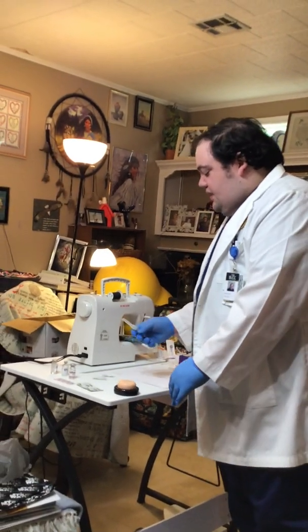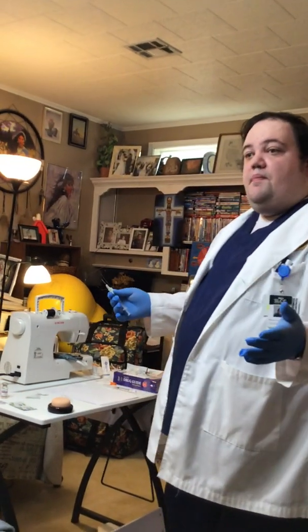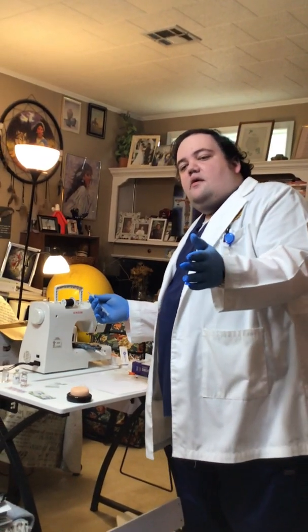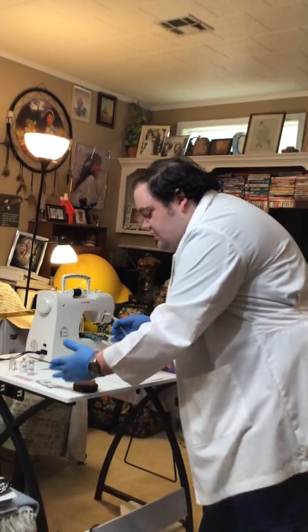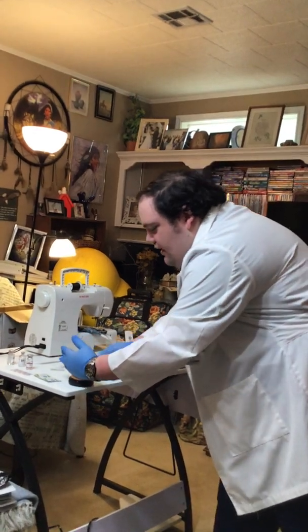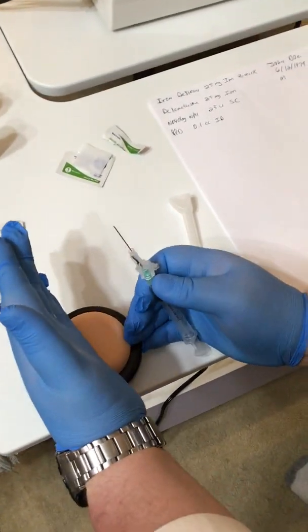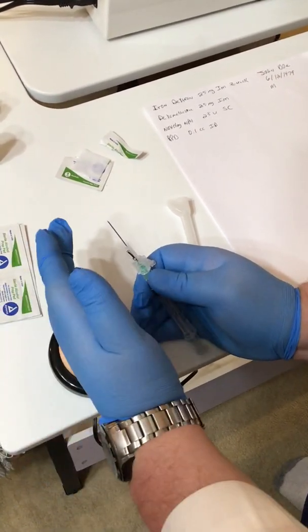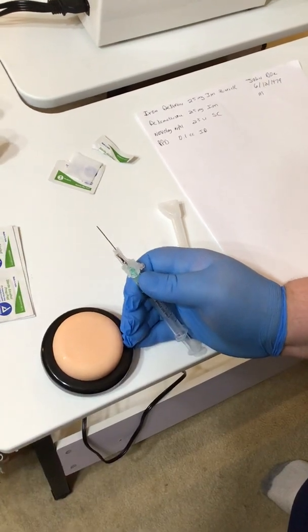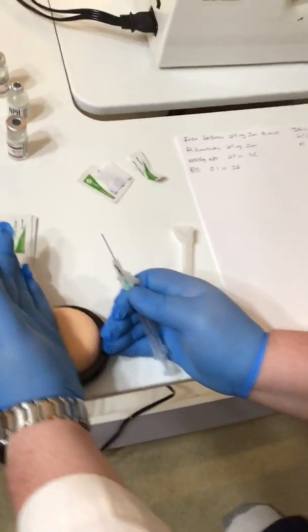So I'm going to take the cap off the needle, and of course, if the patient is in bed, we're going to turn him on his side. I've already explained all this process to the patient. I'm going to take my non-dominant hand. I know there are some shadows here. It's kind of slick, so we have to dry him off because it's not going to work. Kind of a wet glove there. I'm going to move him over like this.